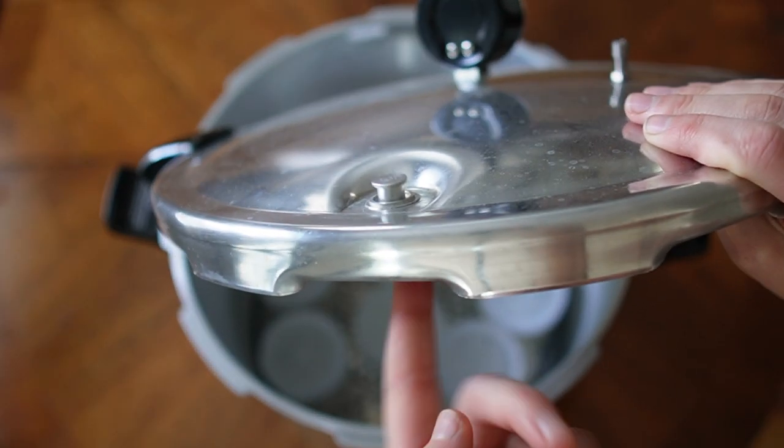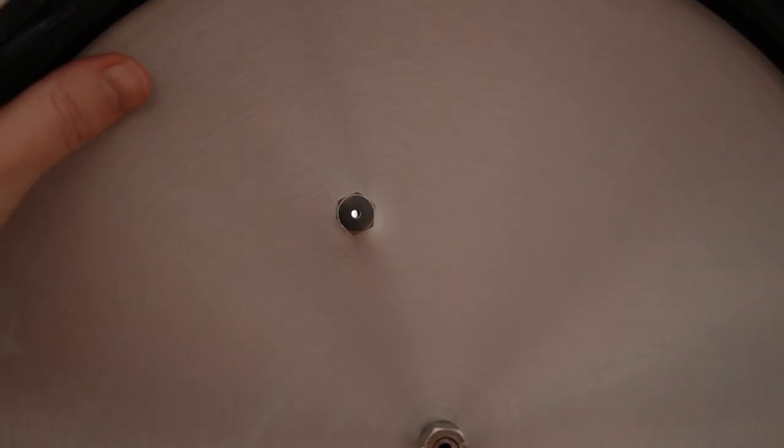There are two safety checks you need to make before securing the lid onto the top of the pressure cooker. First, check that the cover lock can move freely. The second check is to hold the lid up to a window or light source and make sure you can see through the vent pipe. If you can't see through it, you need to clean it out with a very tiny brush or a pin.